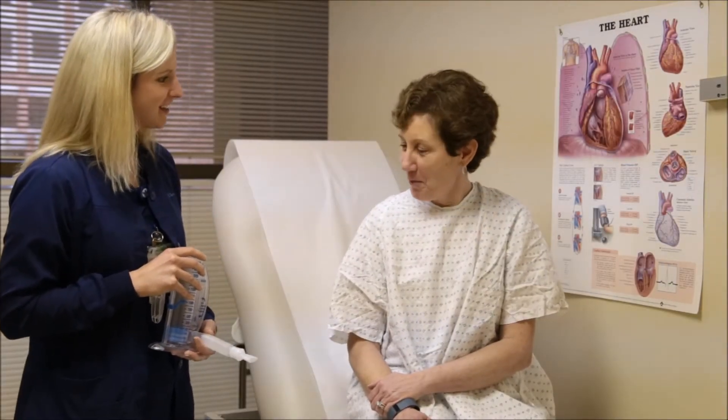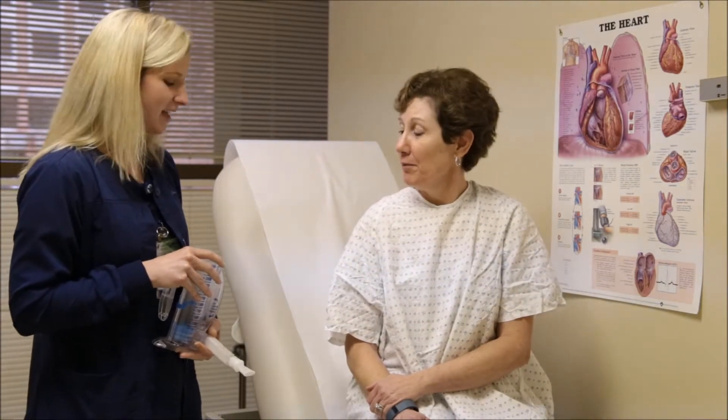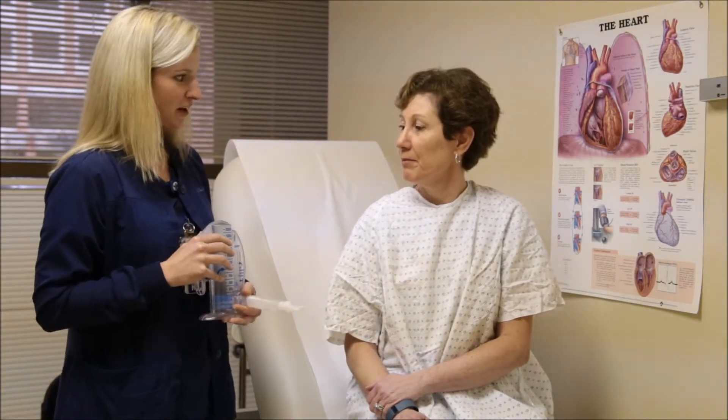Hi! Hi! How are you today? Doing good. I'm Christine and I'm going to be your nurse today, and I wanted to talk to you about the incentive spirometer.